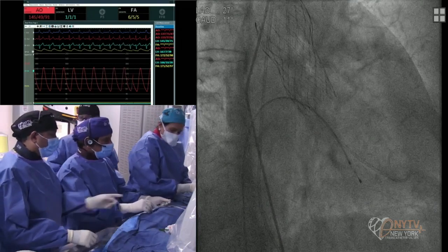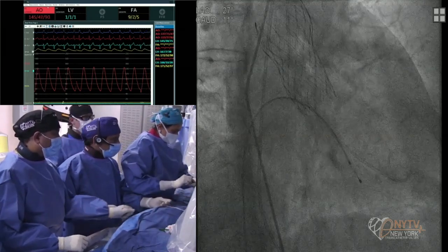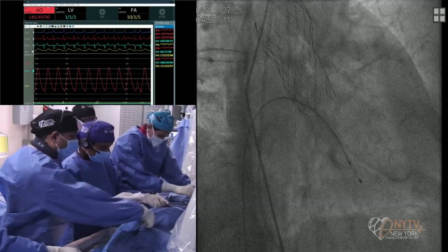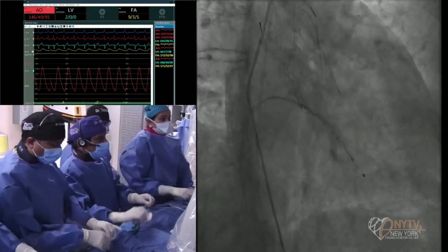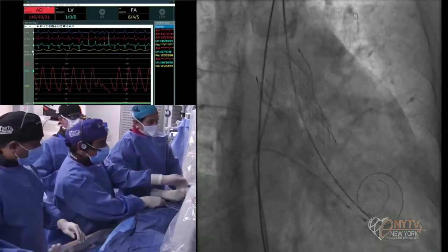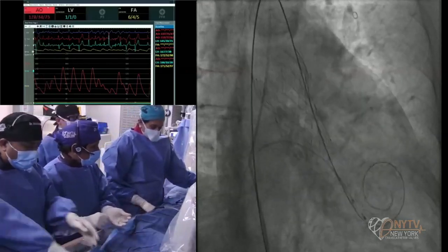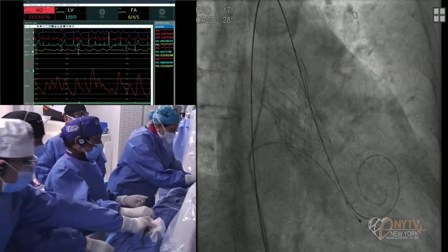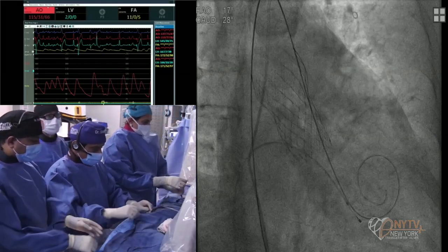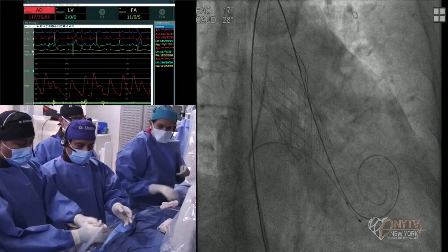But you have to be mindful of the risk of root injury, right? Remember, there was a bit of calcium at the annulus and LVOT. And LVOT is smaller. So I would go slow on the 21, the inflation of the balloon. The calcium is not prohibitive, but it's there. So just something to keep in mind, especially not for the faculty panelists here who do a lot of cases, but for those who might just be starting a program. We always say, you don't want to have a root rupture, which is a very emotionally rich experience. And definitely people will know that they have a scar versus people will probably not know much of your mild PVL.